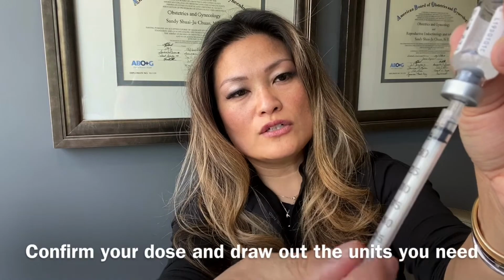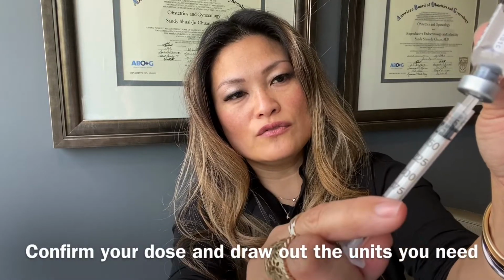And so then you just want to draw it up to what you need. And I need 150 for this protocol. So I'm just drawing it. You see how I'm drawing it to 150? You want to make sure that stopper is right at the 150 mark, okay? If I wanted 225, I just draw a little bit more, okay? And that's it. Then you're done.